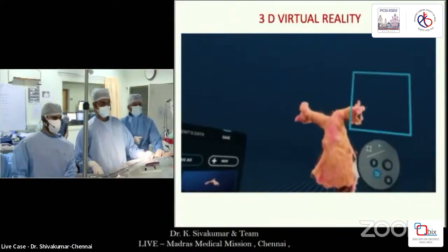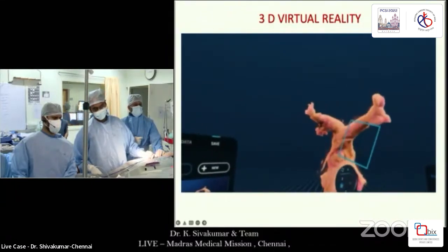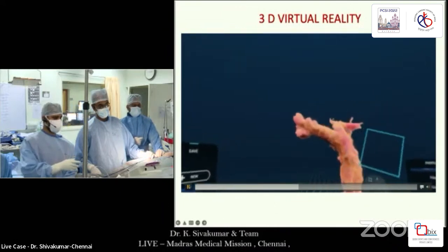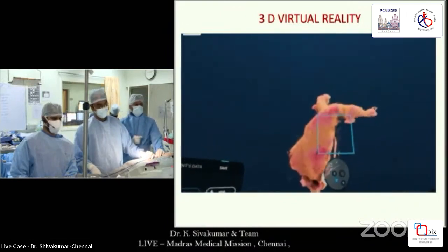So this is anatomical virtual dissection showing the RVOT and branch PAs alone, where we can do similar cuts, and it is showing the LMCA coursing here away from the RVOT. And the same cuts in the cranial and lateral views.